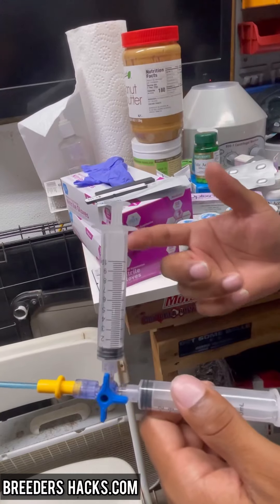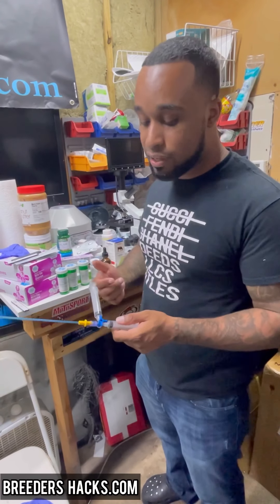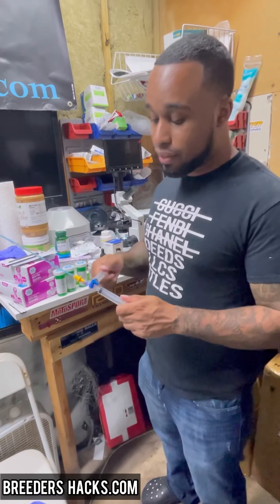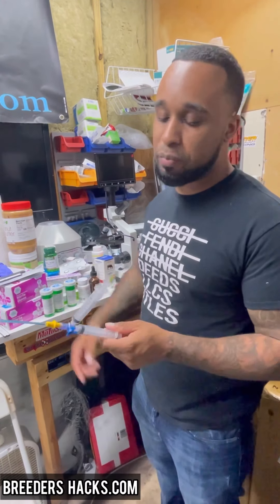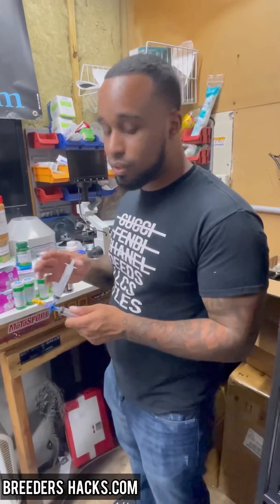We actually have an AI to do today, so I'll show you guys real quick. This is definitely game-changing and going to revolutionize how we do AIs. We sell these on breedershacks.com. The traditional way is still great, but having something like this — especially when you have a female that wants to move all over the place — is a huge help. I've had instances where I took the syringe off to put more air in and got semen coming back out. It was a nightmare. You can pay as much as five thousand dollars for a stud fee, and there goes your collection.